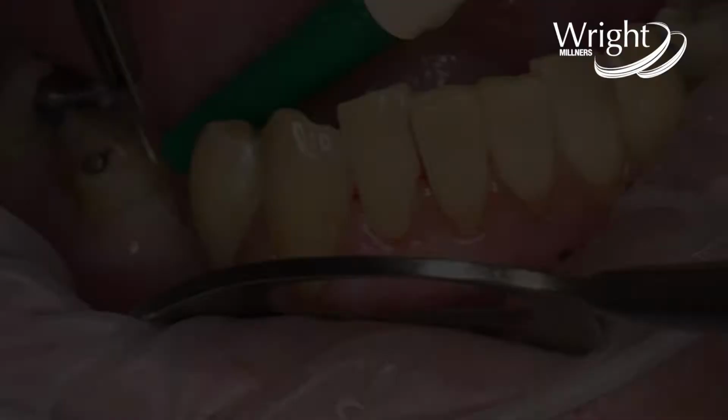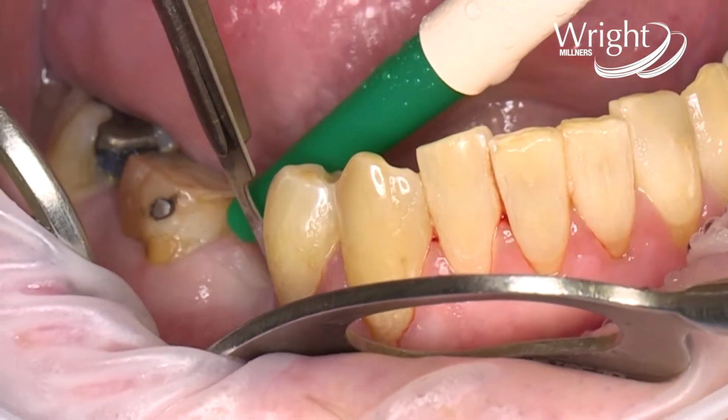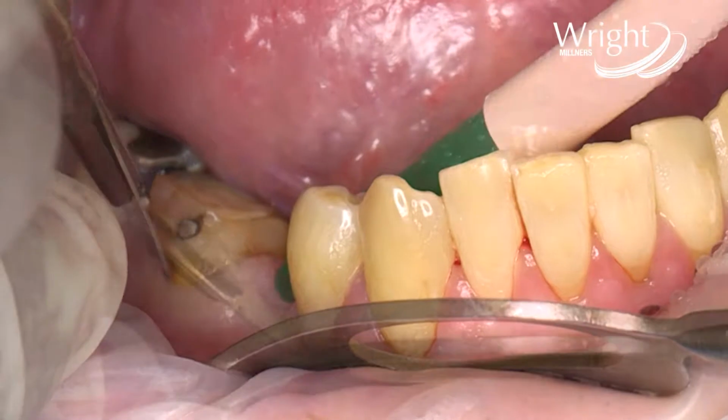Okay, so today's site is a 4-5 site that we're going to replace. There was a recent extraction done, which you'll see on the periapical x-ray. We're going to start with our crestal incision, which we make just palatal or lingual of the midline. It's a full thickness flap that we're doing, and then sulcular incisions along the adjacent teeth.